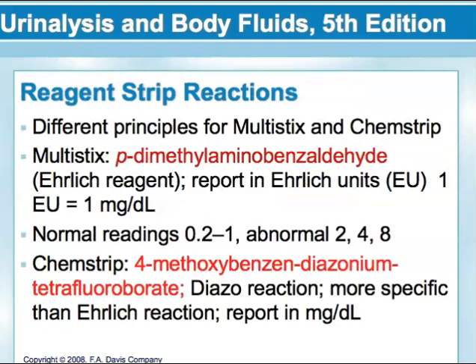Okay, the reagent strip reactions. The test pad for urobilinogen is where the most difference is seen in test methods between the two major manufacturers. So Multistix uses what is called an Ehrlich's aldehyde reaction. ChemStrip uses an azo coupling or a diazo reaction.